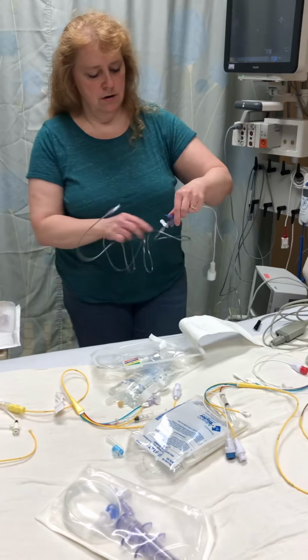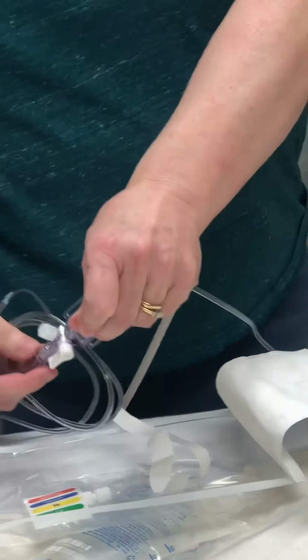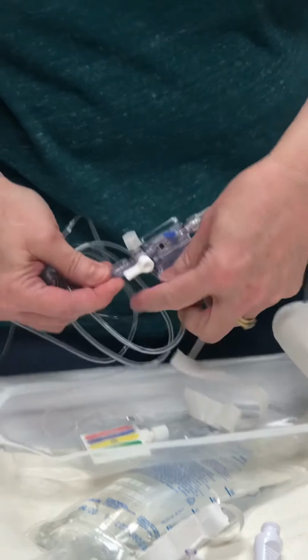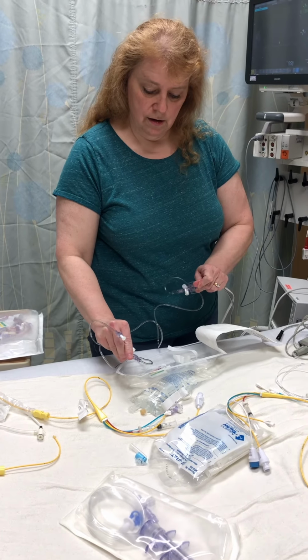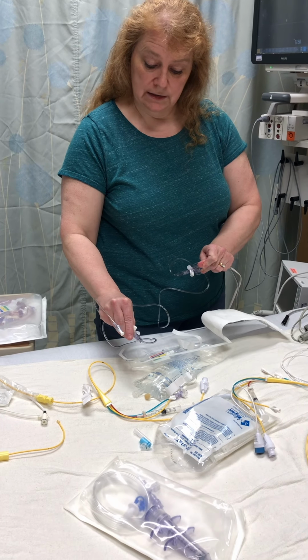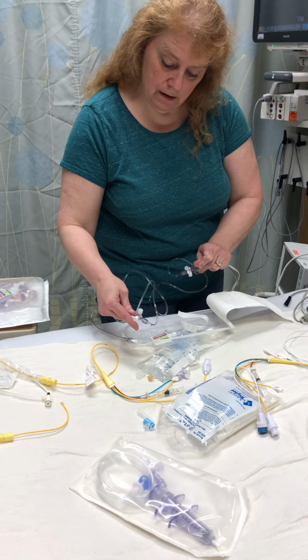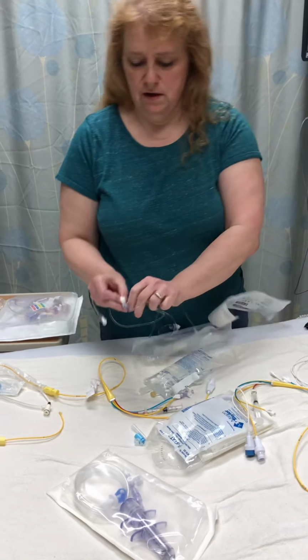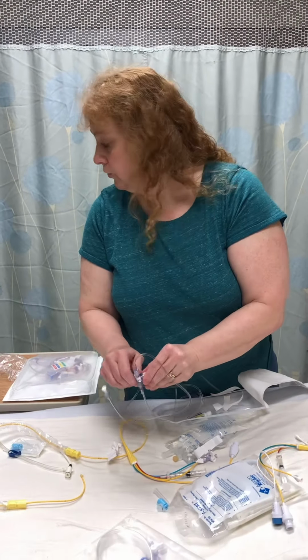Okay, so we're going to prime this. I'm going to get the fluid through there. And then you're going to put brand new stopcocks on there, because if you take a look at this, these actually have a hole in them, so it's going to be an infection control issue.